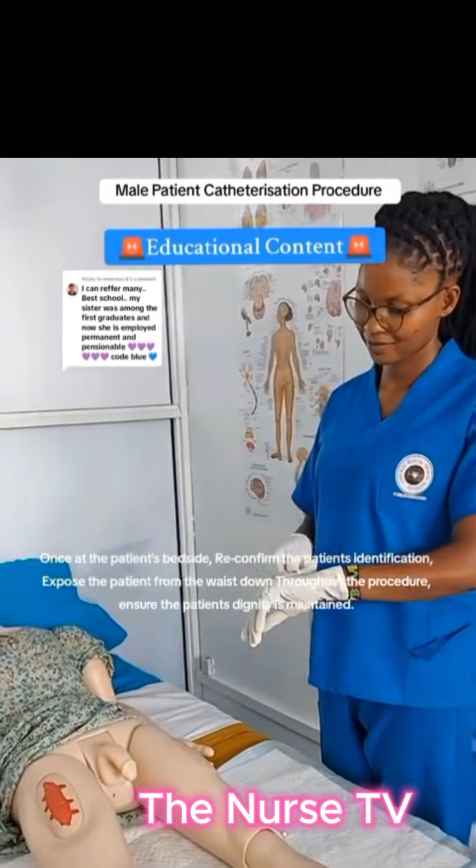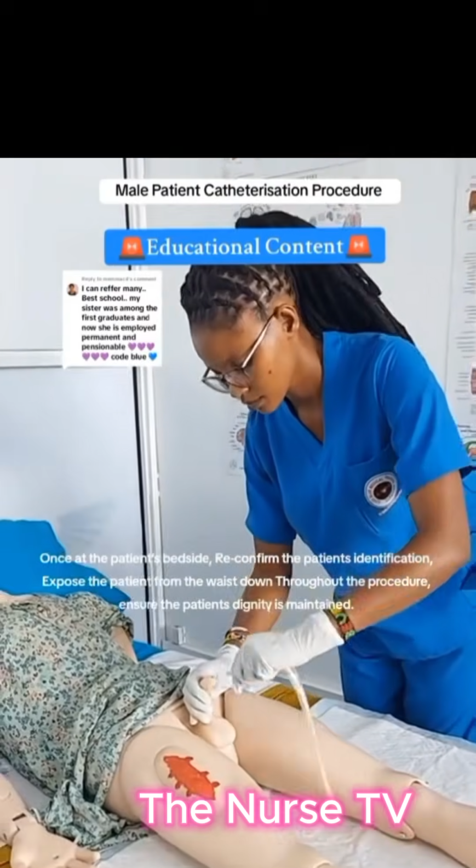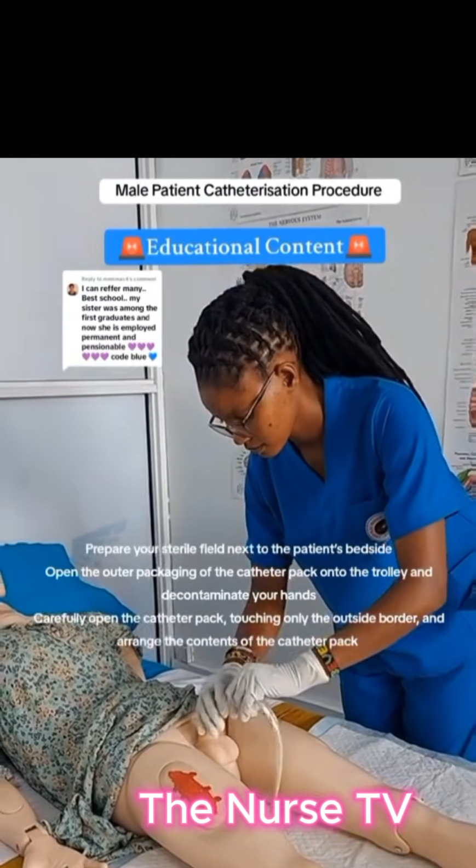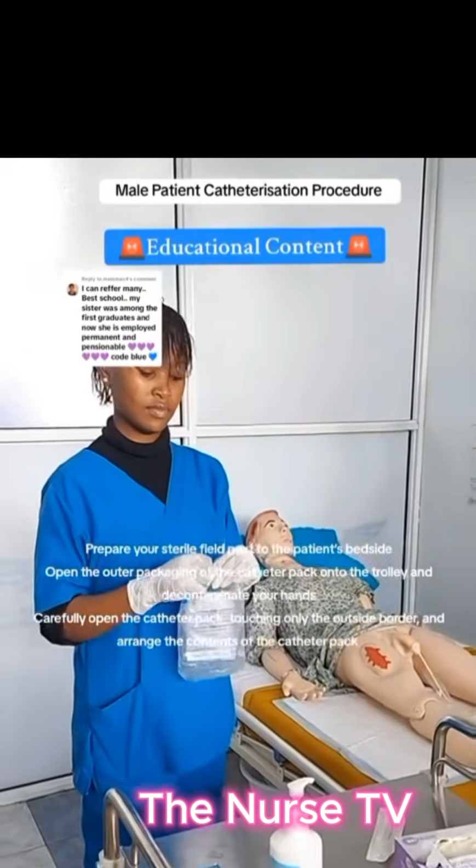Expose the patient from the waist down throughout the procedure. Ensure the patient's dignity is maintained. Prepare your sterile field next to the patient's bedside.